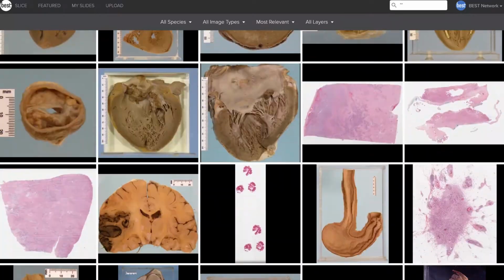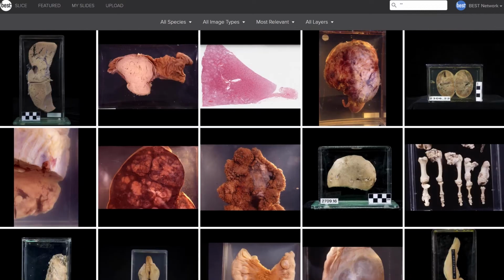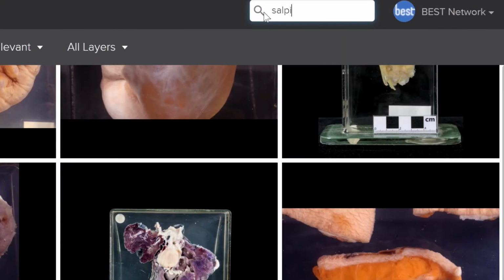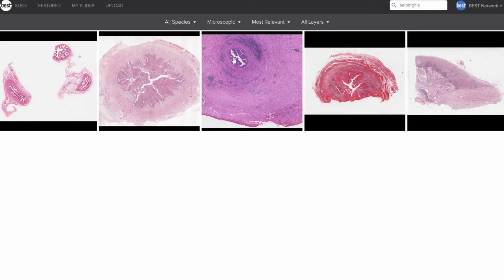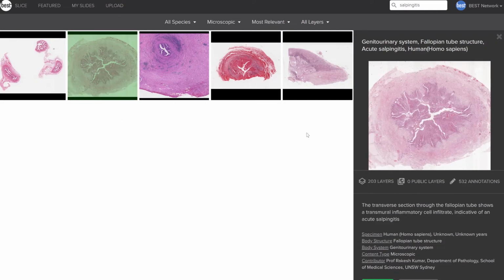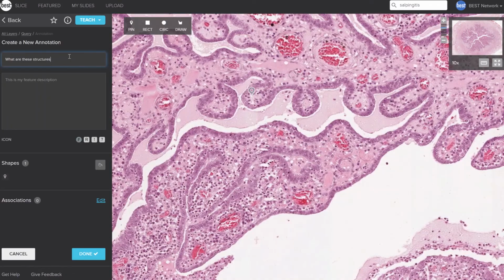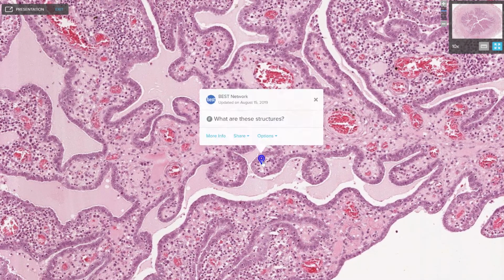And of course, they have a library at their fingertips. So there are slides we look at during the actual practical, but they can type in salpingitis, and they come up with other slides, both macroscopic pictures that have been scanned in and other versions of histological sections that they can look at themselves. And they could even annotate and then email me that and ask questions about that if they wish. That flexibility is another really important aspect that I think has changed the way students learn in pathology.